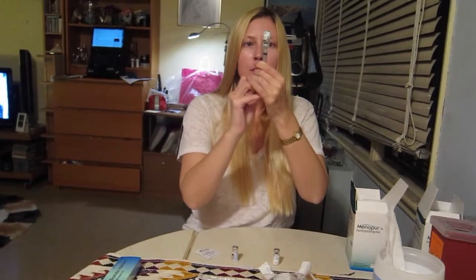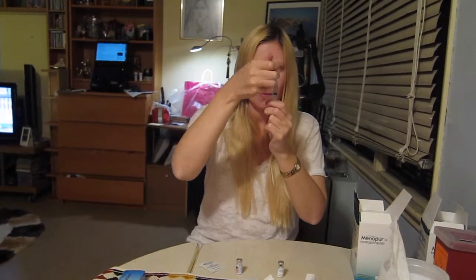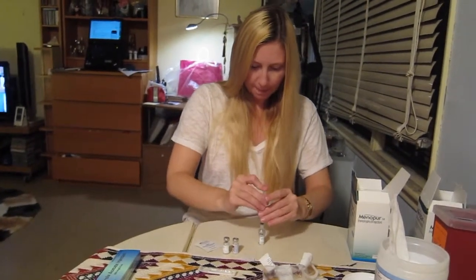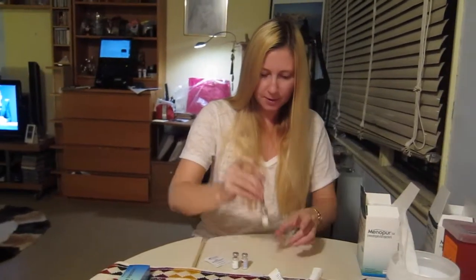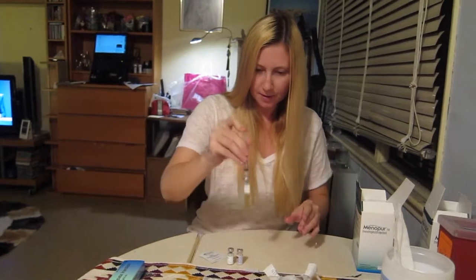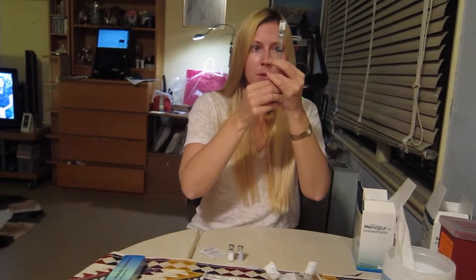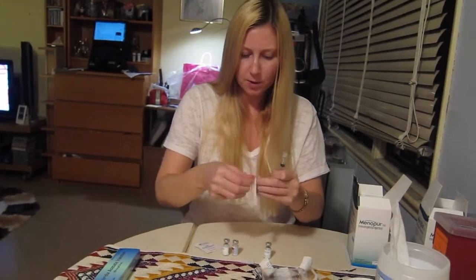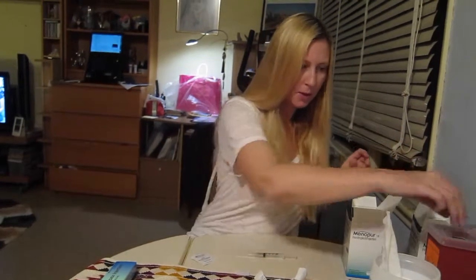Then I draw. There is a chance to spill some of it, so I draw everything that is in the bottle just in case I don't lose any of the medication. I inject into the second bottle with another 75 units so I get a total of 150. Shake it and draw. Just swap to a needle of appropriate size, and it's ready. I deposit both used needles in the sharps box.